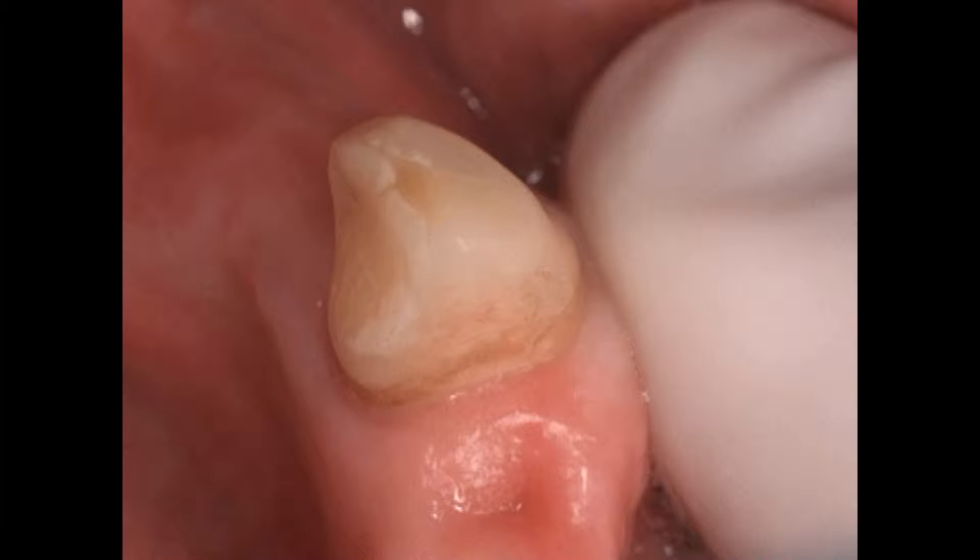Here's an interesting case we're doing quite regularly at the University of Michigan. We have virgin canines that are going to get a partial denture, but we want to have a rest seat on this partial. In the past, what we would do is bond a composite rest seat on there, then grind in the shape of that rest seat, make sure it had the right guide planes, take an impression, put it on a surveyor, and check to see that it drew.